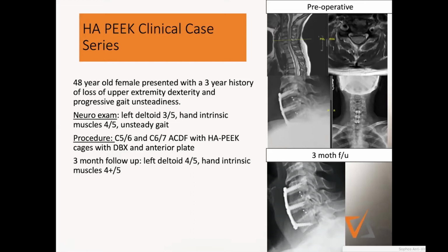Sig, have you seen bone formation that early in your practice? Well, I think, Christoph, that's terrific. I think that's a testimony to both your skill at end plate preparation as well as perhaps a device that you use in creating stability. But yeah, that's not common in my practice. I wish I could say that I see that often. I've been using a lot of structural allograft in my ACDFs most commonly, to be honest, and I'm not reliably seeing that early.